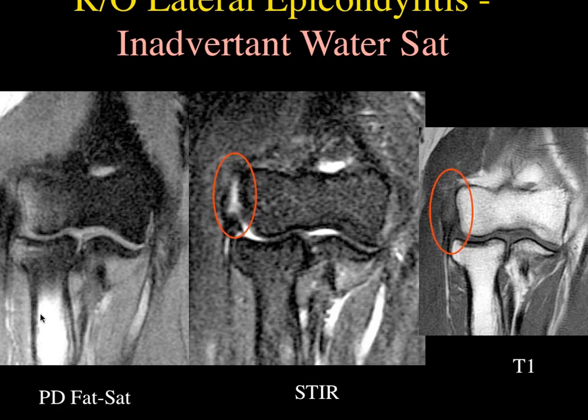Dr. Cruz, why do you get the failure of fat saturation in the sagittal more than the coronal? Is that because of the phase and frequency? No, you shouldn't. There are a number of things that can occur. One could be something that has to do with your magnet; each magnet is a little bit different in terms of its shimming. It could be due to the way your shim is on your particular magnet.